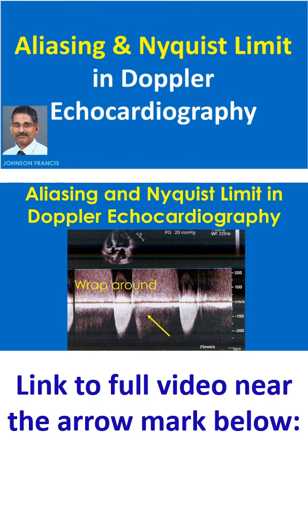The tracing can be depicted upwards to its full extent by adjusting the velocity limit or by adjusting the baseline downwards. The dense jet seen below the baseline is the forward aortic flow. The peak forward gradient is measured as 20 mm of mercury, which does not indicate significant aortic stenosis.